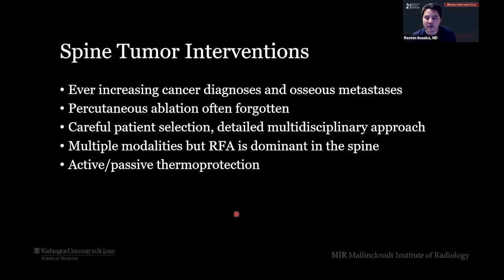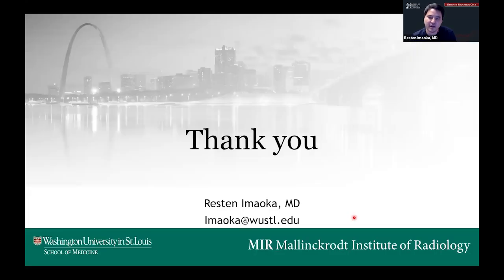And then there are a lot of different modalities for ablation, heat or cold based, but in the spine, RFA is by far the most dominant. That's with decades of data now showing that it's safe and very controllable to produce a nice controlled ablation zone. And then we think about our active and passive thermal protection as well, which is a whole other discussion on its own. That's it. Thank you guys.